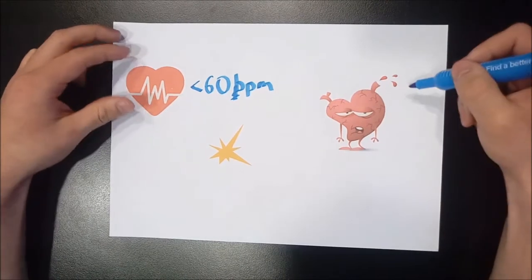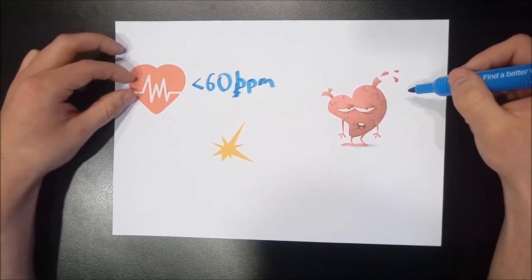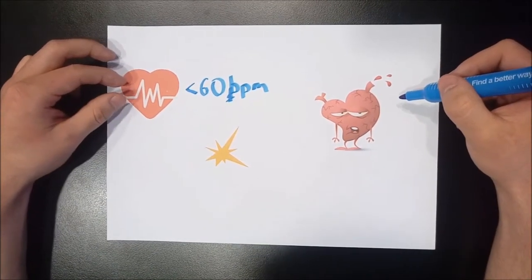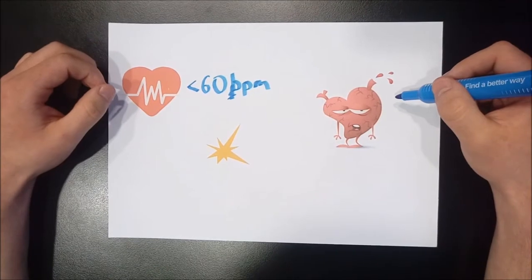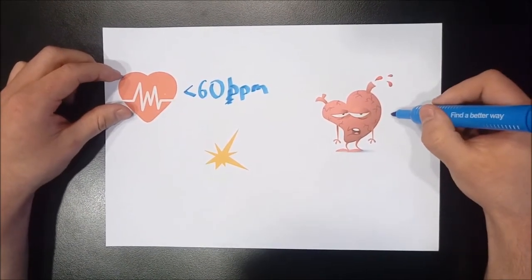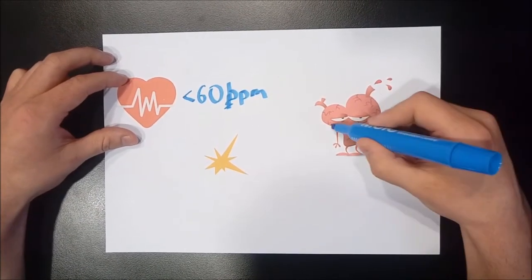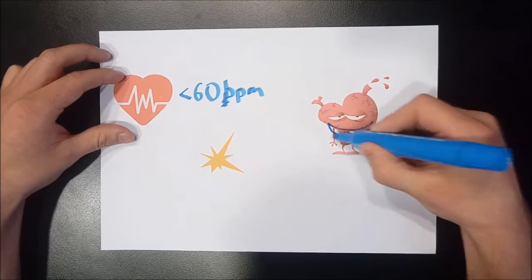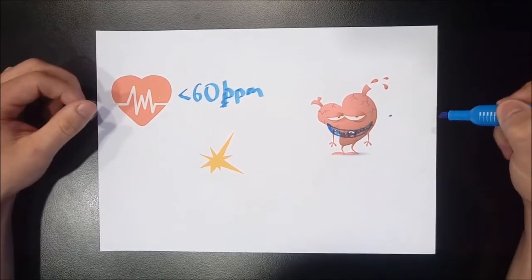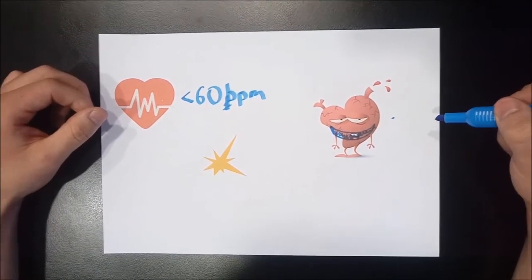Heart block is a disorder where the electrical pulses through the heart are dampened or blocked from spreading through all of the heart muscle. A bradycardic heartbeat is often caused by heart diseases such as coronary artery disease and endocarditis, or by a weakening of the heart muscles due to aging. The pacemaker has been developed for patients whose natural pacemaker is not functioning properly and hence require an artificial one to speed up their heart rate. I will now hand over to Yusuf, who will talk about the system design of the pacemaker.